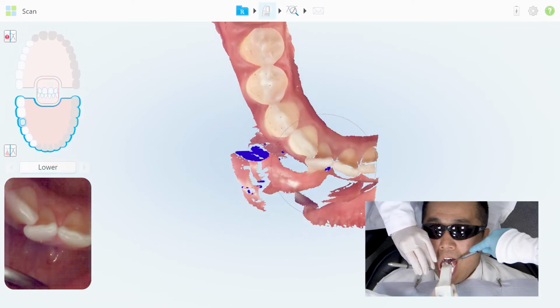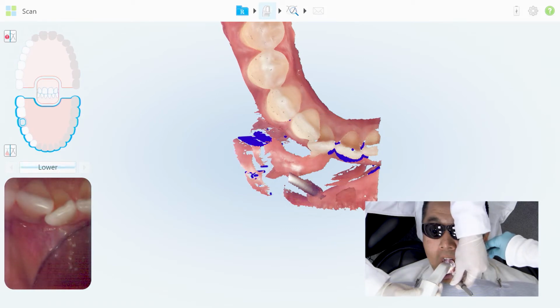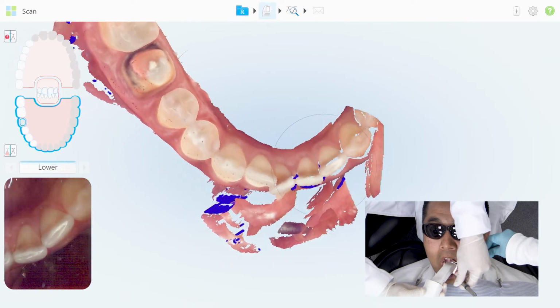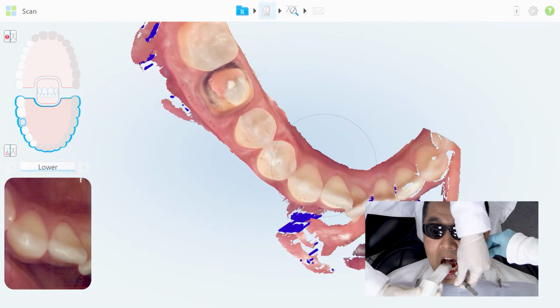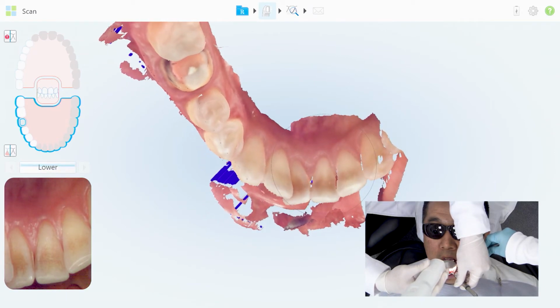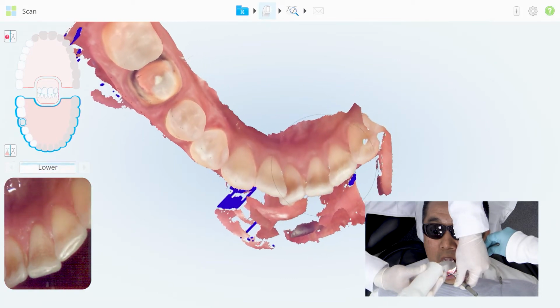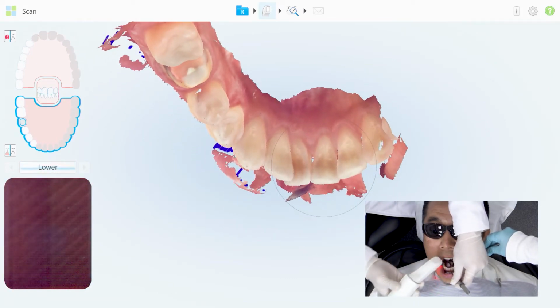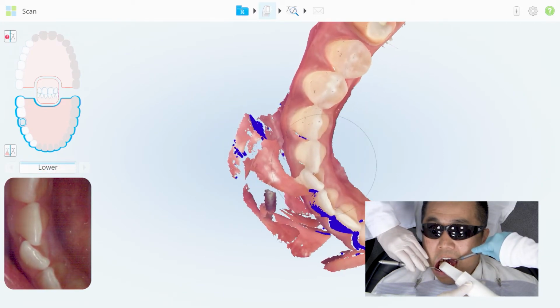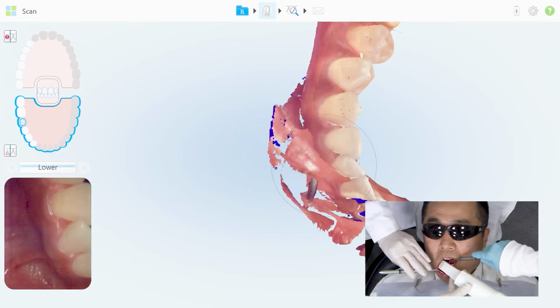So as you work your way toward the anterior, you not only need to make sure you keep the soft tissue in check, as in retracted and away from the area you're scanning, but you also want to continue moving slowly and generate those facial and lingual surfaces slowly. I like to capture mostly from the incisal lingual first and build those areas, and then rotate to the facial. I usually finish the facial with the very last. Close a little bit more, there we go.